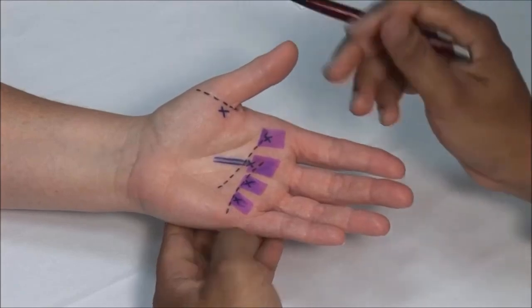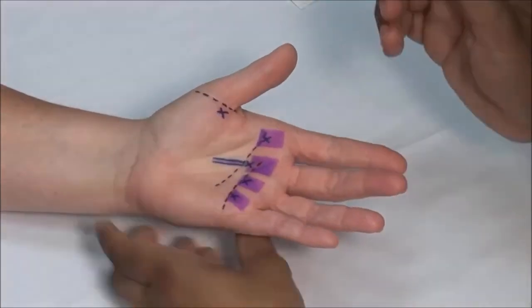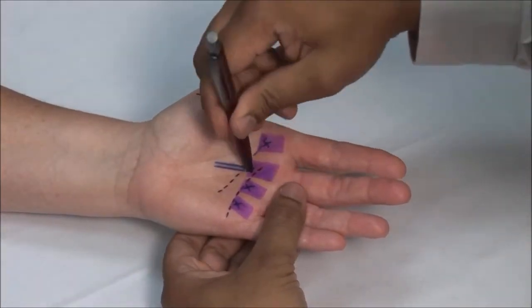Mark the injection point with a retractable pen. In this case I'm using the third flexor tendon for demonstration.